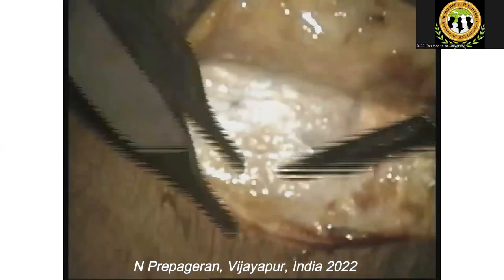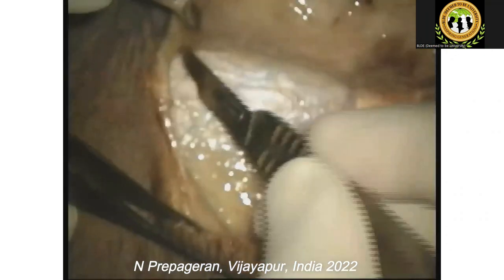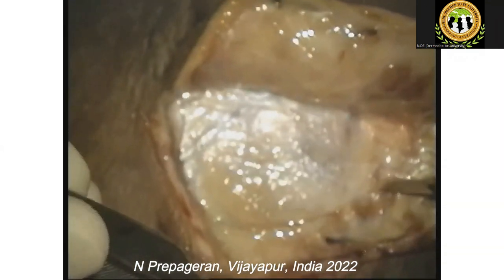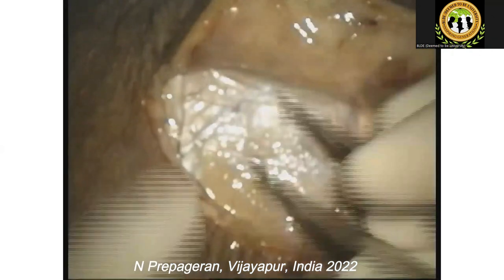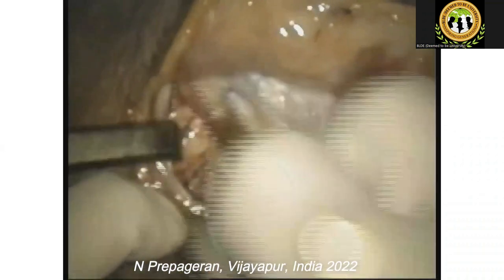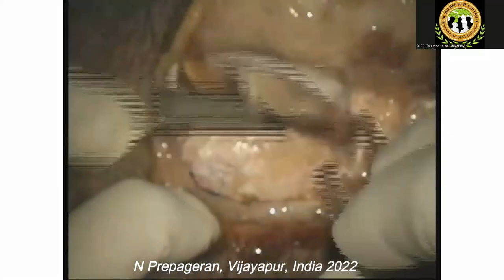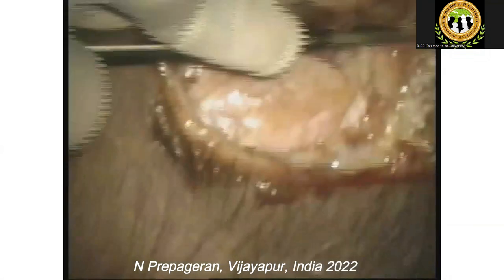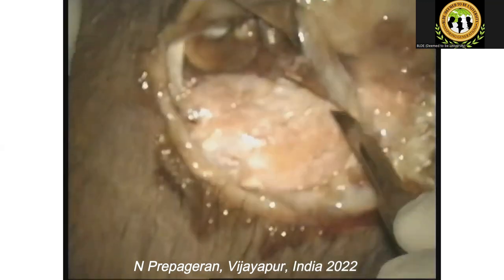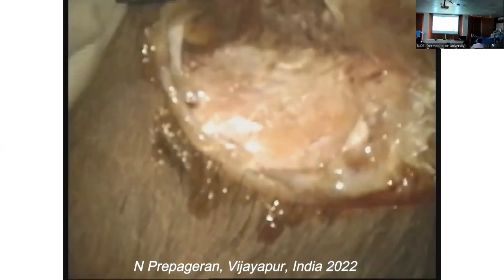Same way, you want to cut posteriorly a little bit so that your self-retaining retractor can go in very nicely. Once you have done that, you want to make another big C, and then we'll push all the tissues upwards. There we go, until you're able to expose the entire bone. So now you can see the entire mastoid portion is exposed.